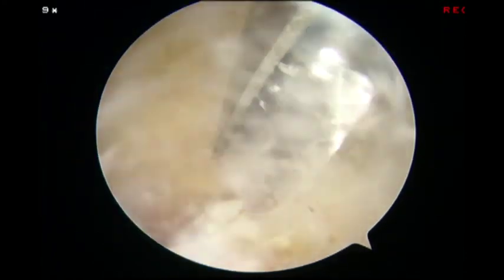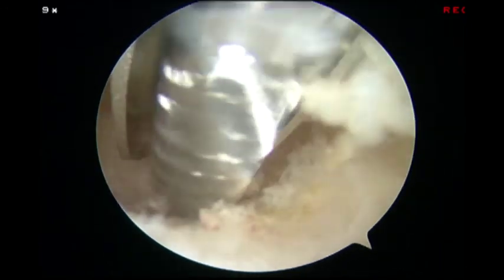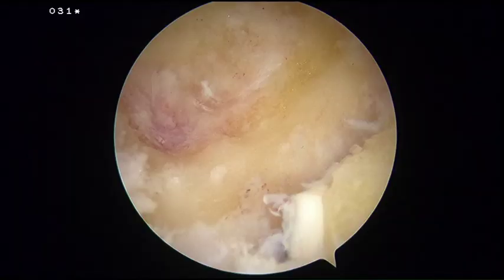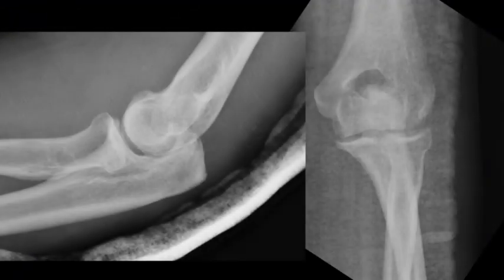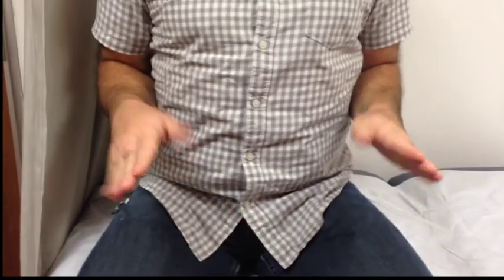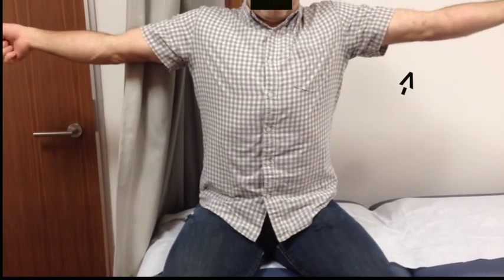The elbow was ranged to ensure that no bony impingement was present. Prior to leaving the OR, the elbow was gently manipulated to release any anterior soft tissue restraints. Post-op x-rays show removal of osteophytes and normal bony contour. At two months follow-up, the patient has no elbow pain or stiffness and has full range of motion in the flexion-extension and pronation-supination planes.